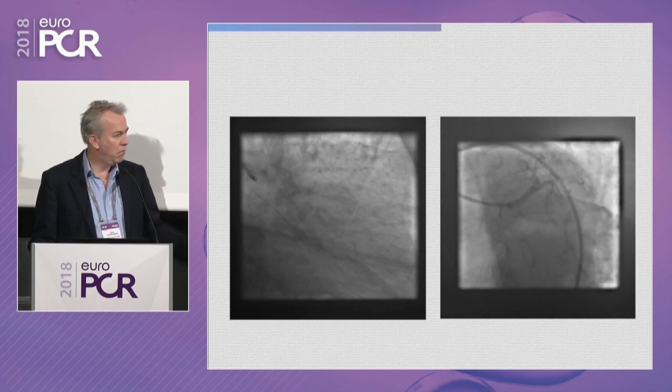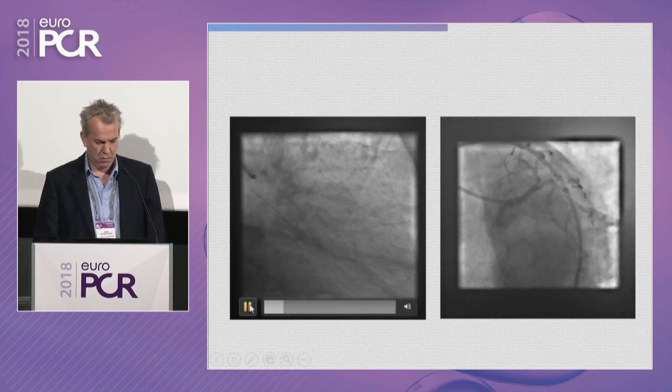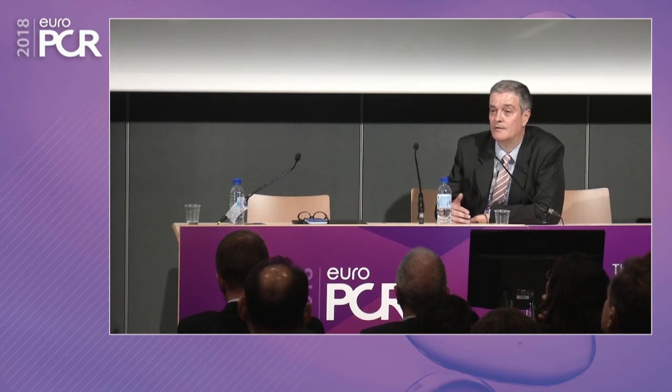But at least for long-term outcome, we know for sure that SKS with a long new metallic neocarina is bad, with more than 6% late thrombosis. Unless the patient is really hemodynamically compromised, and in that case I would fully agree with you, if it's a rescue procedure, the simplest possible is to do V stenting with short proximal overlap. But these were stable patients, so I think you could have enough time to think of strategy, plan and execute.